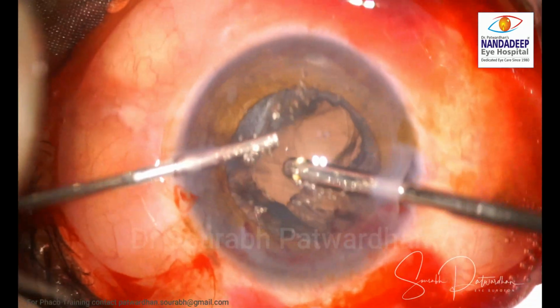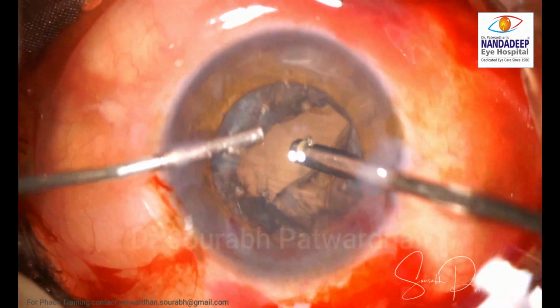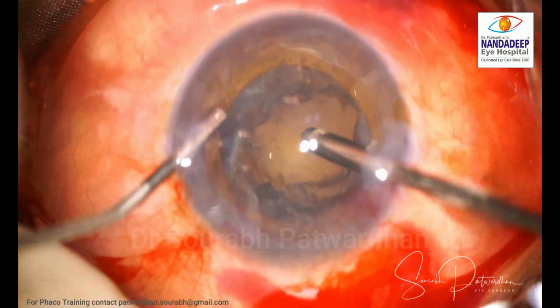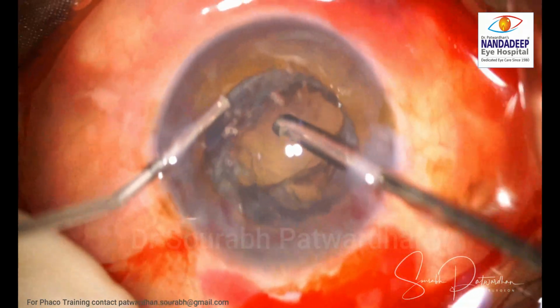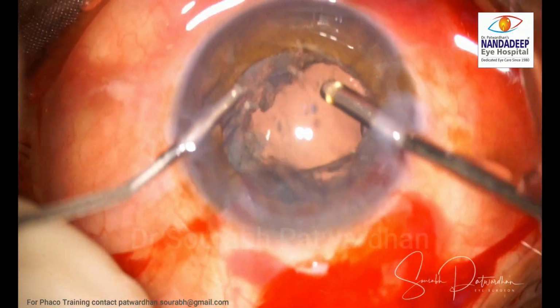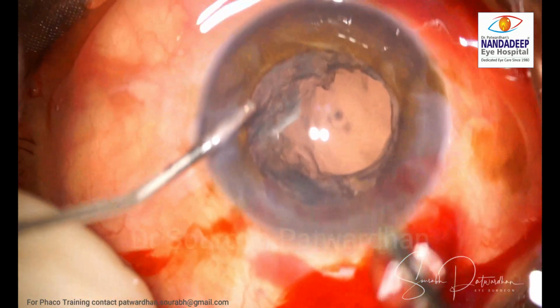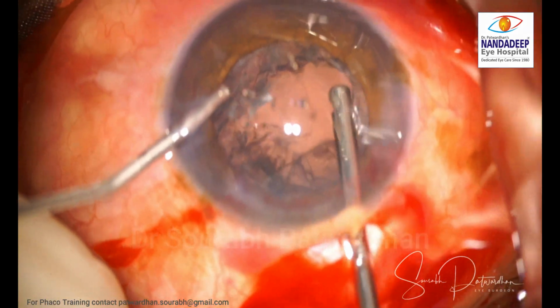So I am using the previous incision here, and the mistake I am making now is that my fluid flow from my left hand is going over the anterior hyaloid, thus causing further disruption of the posterior capsule. Now I directed it away from it. Now my hand was getting stuck because of the patient's nose. This was a nasal incision, so I decided I will go from the scleral tunnel.